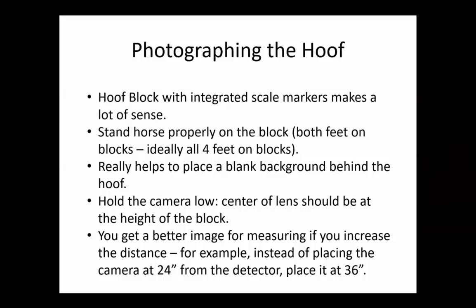And here's the summary bullets. A hoof block with integrated scale marker makes a lot of sense. One less thing to handle around the horse. Stand the horse properly on the block, as always.